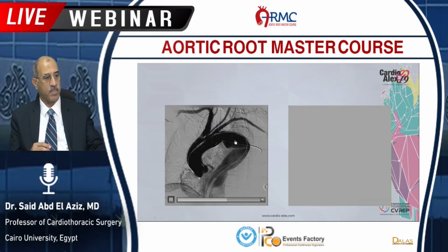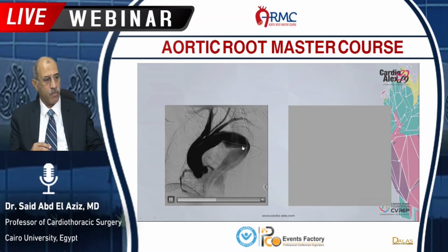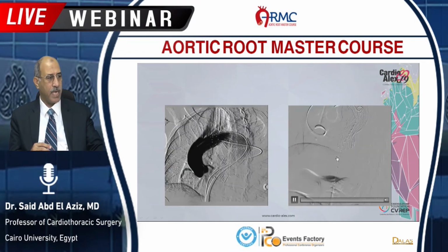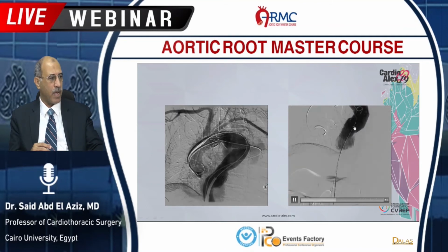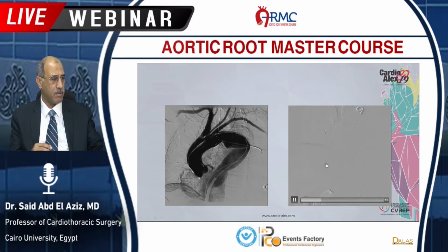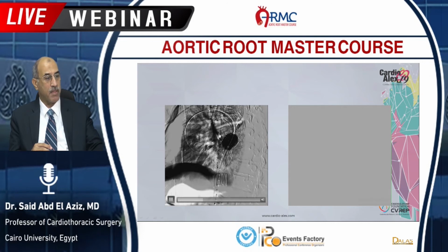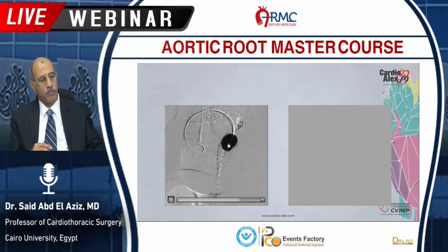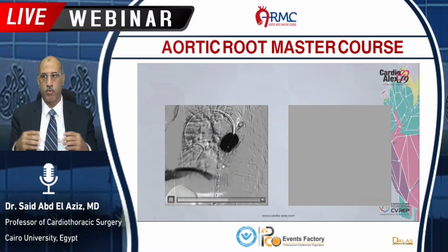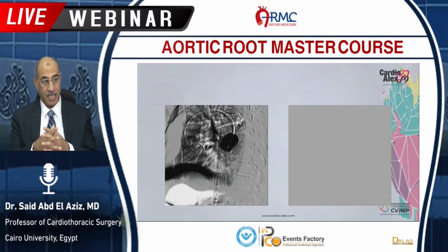Here we deployed the first stent, but we still have an endoleak from below because the aneurysm is too long, so we have to put 2 stents. Next, we are injecting to see the second stent, and here we are putting the second stent, and then we do what we call ballooning. In some areas, the overlap between the 2 stents, we have to balloon to coapt well and to prevent endoleak.